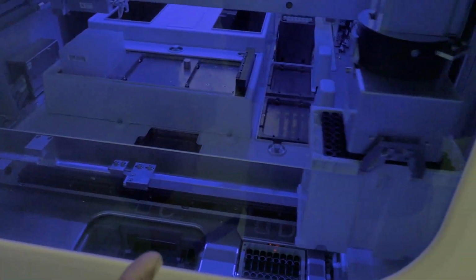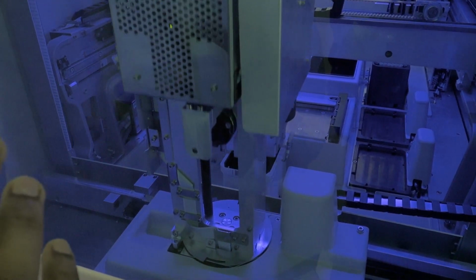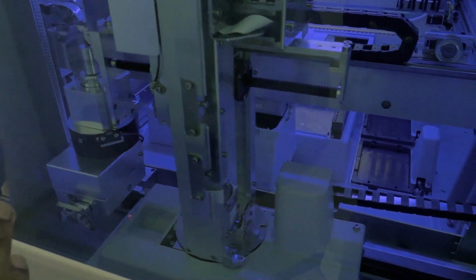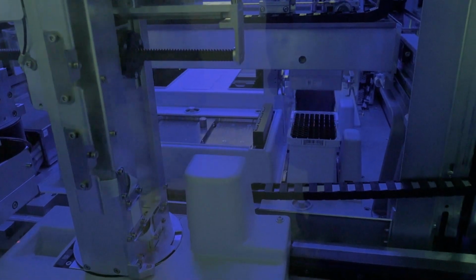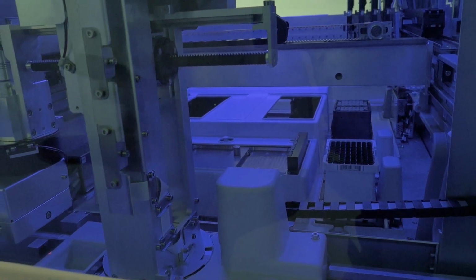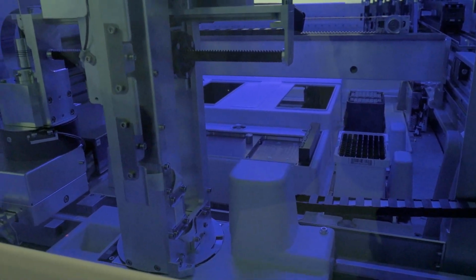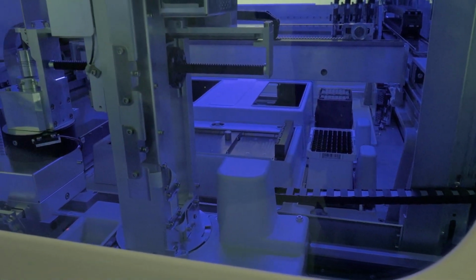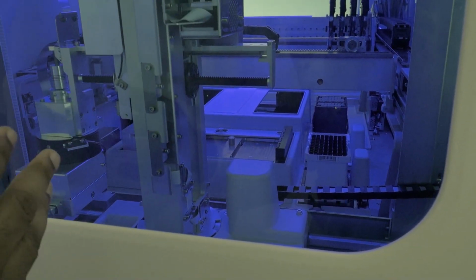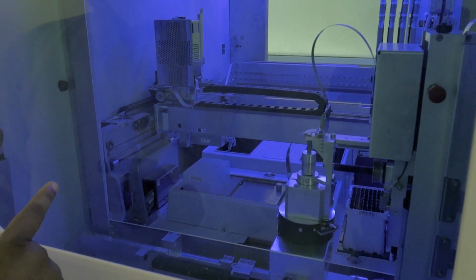So likewise, what the robotic arm does is that inside this particular unit, all these items that are consumables, reagents, all are stored inside. So what it does is it brings onto the area. For example, now this is the first part of the machine where the sample is processed. So whatever that particular stage requires, the robotic arm brings it in. So what it truly does is it cut down the manual work. Any chance of compromise that could happen to a human is eliminated.